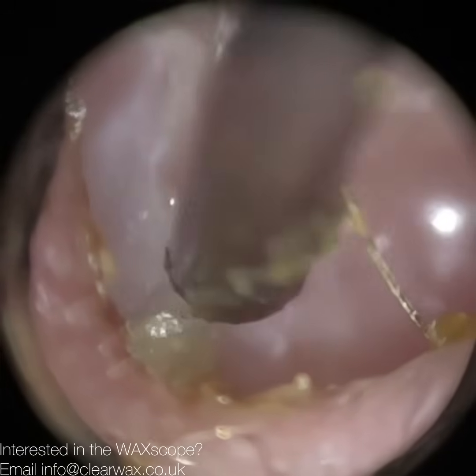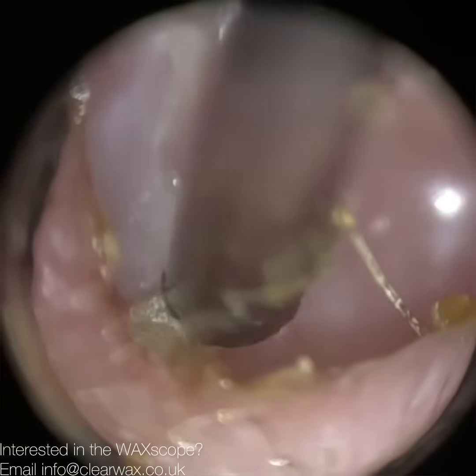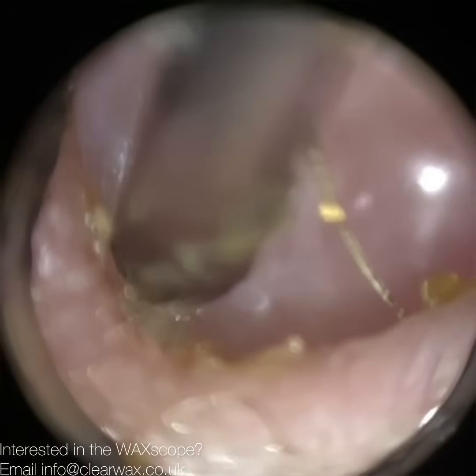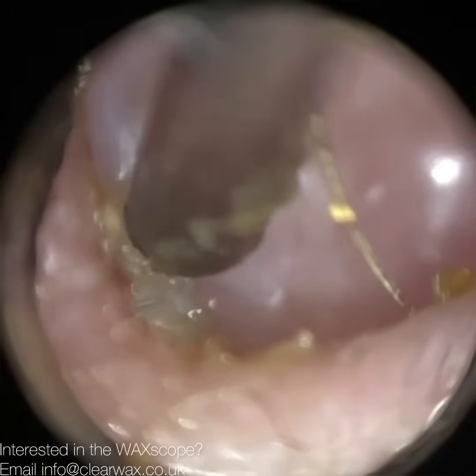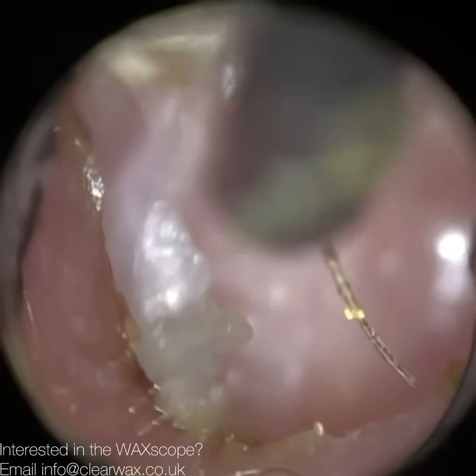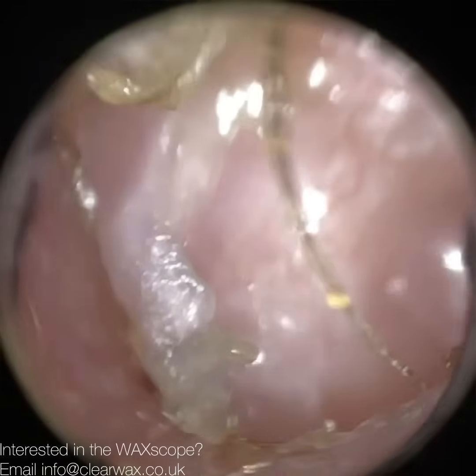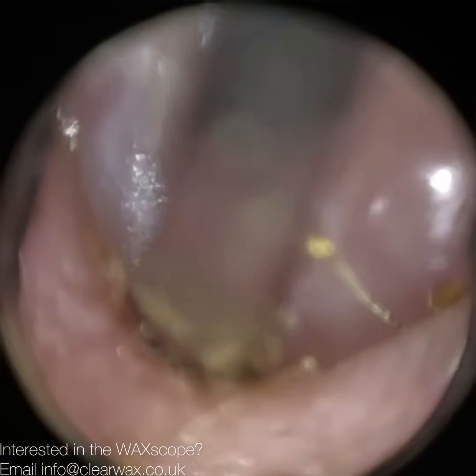So when I'm removing this, I'm actually standing up and I'm angling downwards into the crater itself, and you've just got a bit more keratinous debris here, so I just want to peel this away. I'm going to be very gentle because we are working on the bony part. Of course, this patient is missing a lot of bone, but the bone that they do have is still sensitive. So I've just changed the focus, and I'm just going to re-enter. I'm using the fine end for this.